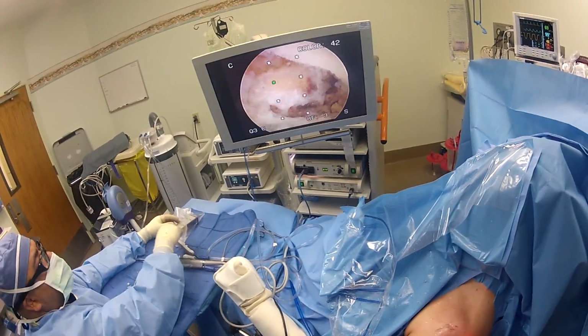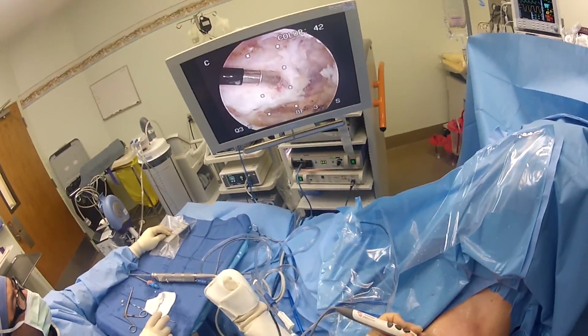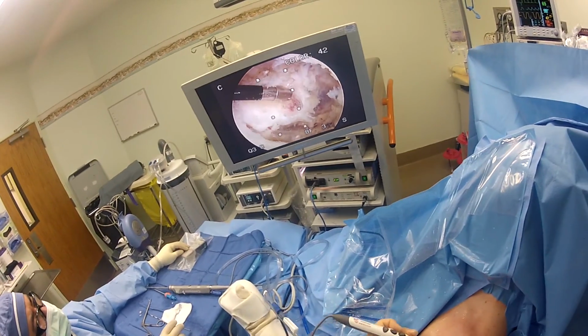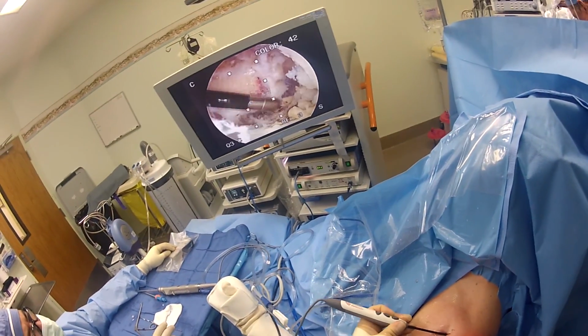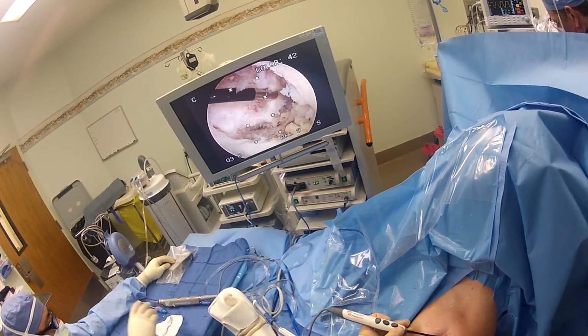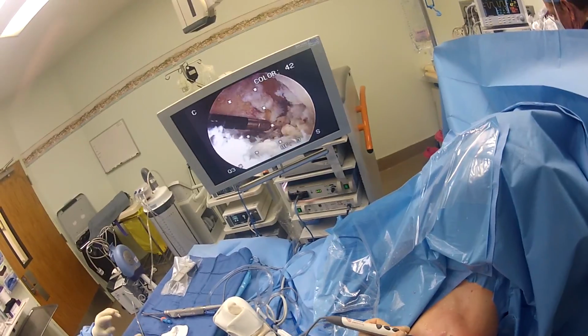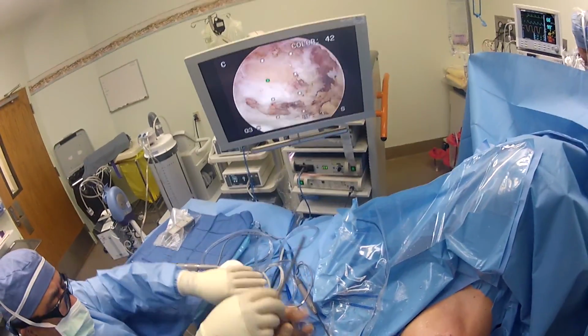Arthrocare. And there you have it. That's what osteolysis of the distal end of the clavicle looks like. You can see it's a fairly easy AC joint excision, but at least you got a sense of what it looks like when you get in there. You know, sometimes you could miss it on x-ray, and when you're in there doing the patient, realize what's going on.